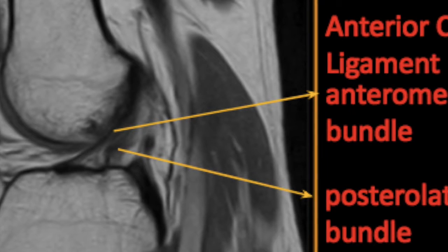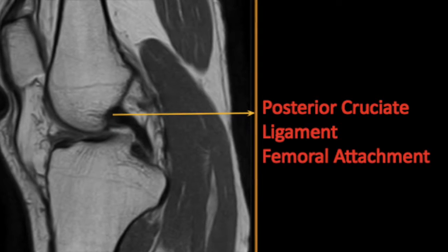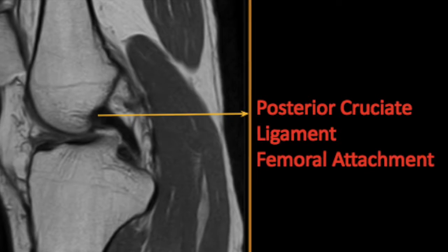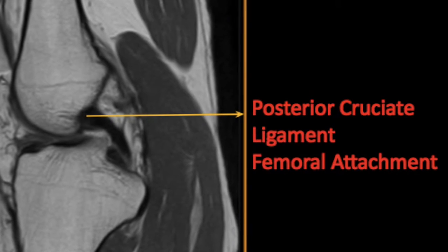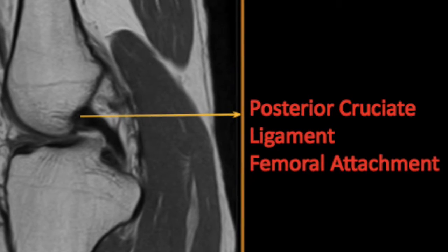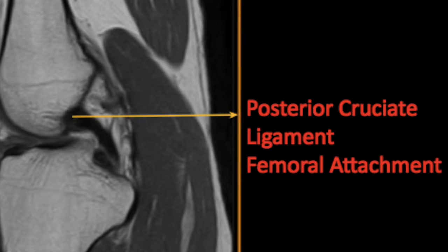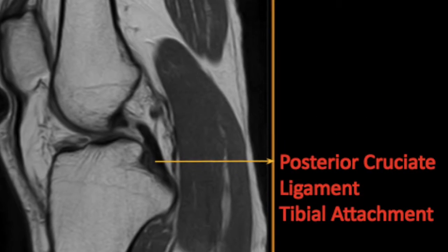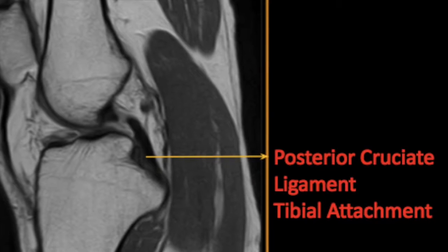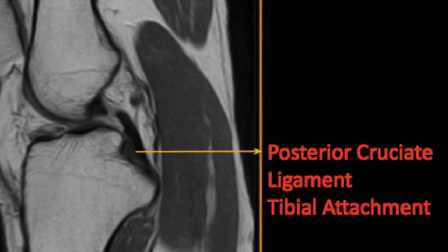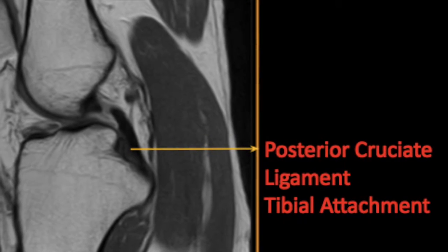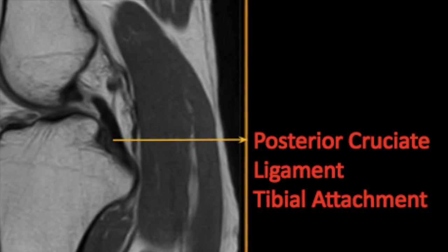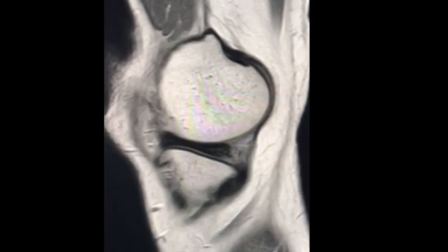Coming to the posterior cruciate ligament. The posterior cruciate ligament originates in the lateral aspect of the medial femoral condyle, crosses the ACL, and attaches to the posterior intercondylar fossa of the tibia. It is a central stabilizer of the knee, restraining posterior tibial displacement on the femur.